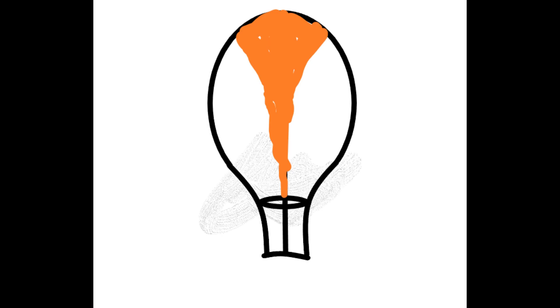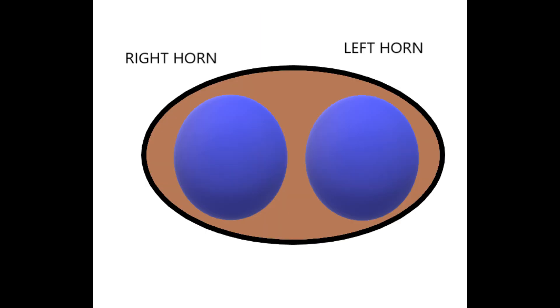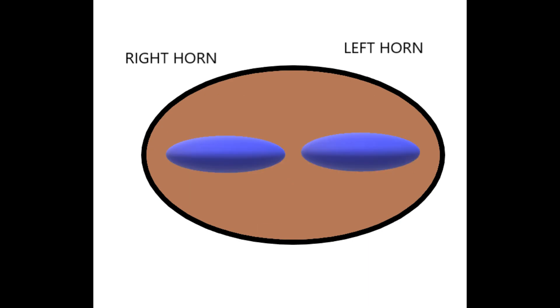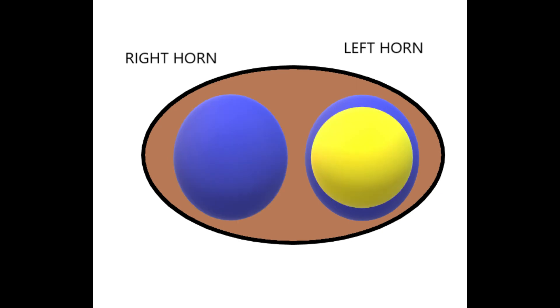In this image you can see a uterine septum, the internal os, and the cervical portion. Most of us think that the uterine cavity is going to look like both horns are dilated when doing hysteroscopy. But actually in the resting position, the uterine horns are going to be collapsed like coins horizontally. When you do hysteroscopy, one horn is going to be dilated under the effect of normal saline and the other horn is going to be collapsed — and that can cause problems.